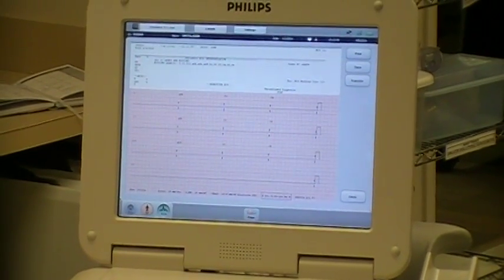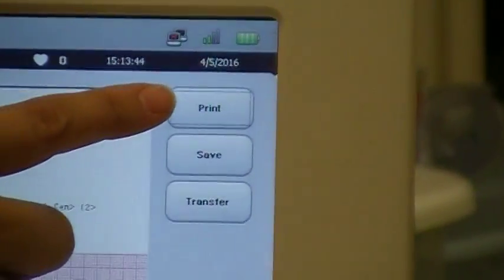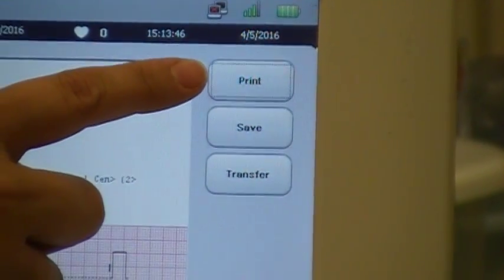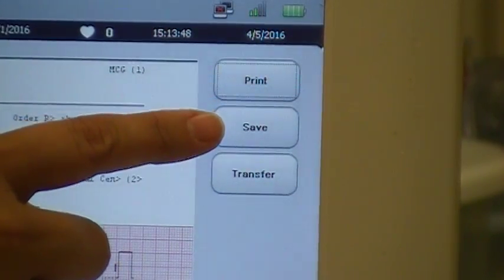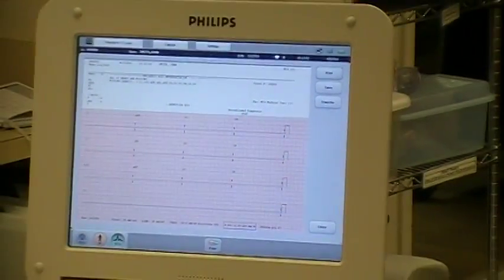Once your EKG is acquired, you want to press the buttons on the right side to print it, save it, or transfer it into the electronic medical record.